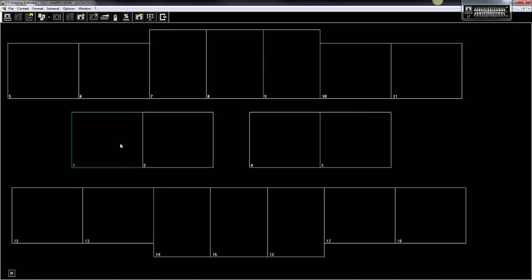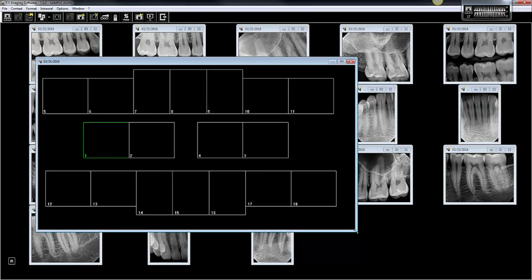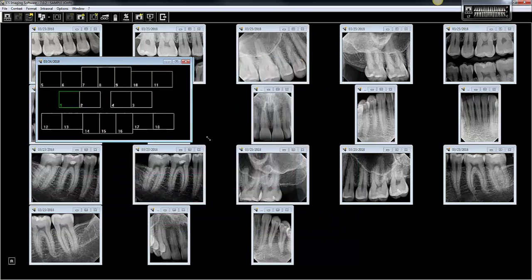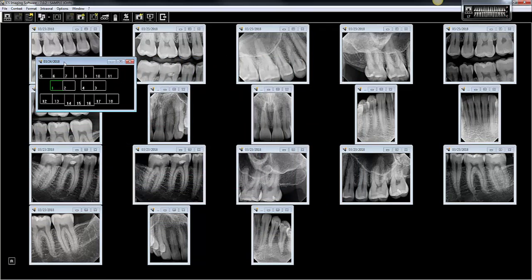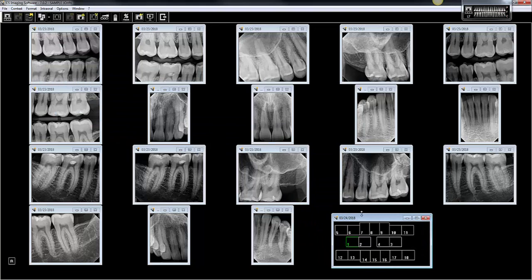This is a full-mouth series format, but it's designed to hold JPEG images rather than radiographs. So the format is now open, and all of those images are open behind it. The next step is to click this icon to reduce the size the format is displayed at, then hover over the corner of the border, left-click and hold, and reduce the size even more so you can drag it down where there are no images.